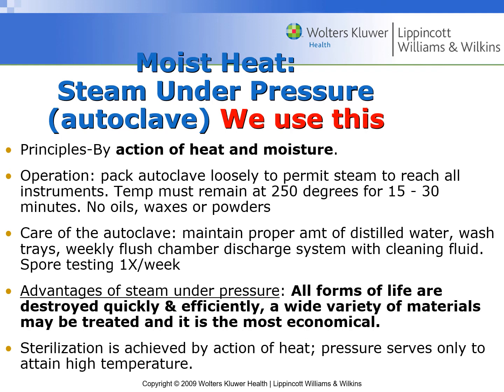So the advantages of steam under pressure are that all forms of life are destroyed quickly and efficiently. A wide variety of materials may be treated in there without being ruined, and it is absolutely the most economical, which is why most offices have them.